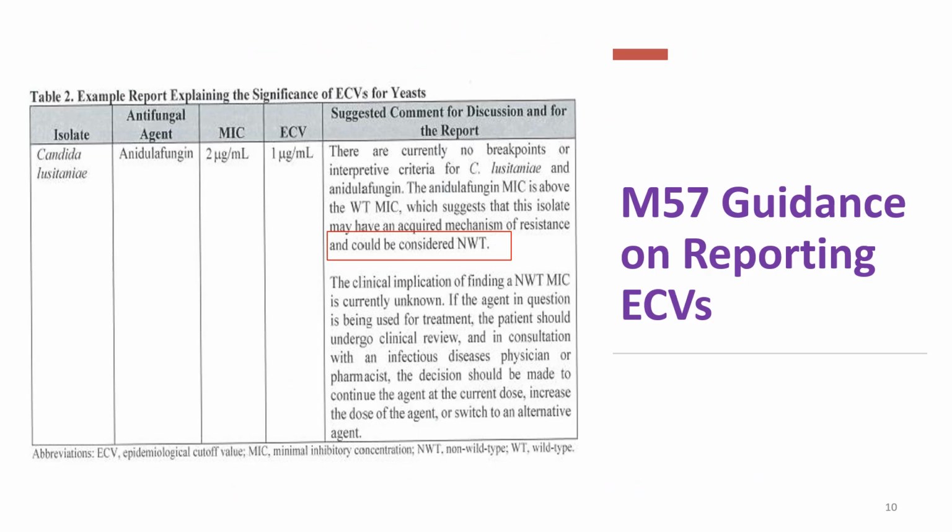Similarly, for example, Candida lusitaniae: the MIC is 2, while the ECOFF is 1. So since the MIC is more than the ECOFF value, it belongs to a non-wild type. That means it has some resistance mechanism. Now, if the agent in question is being used for treatment, the patient should undergo clinical review. And in consultation with the admitting physician or pharmacist, the decision should be made whether to continue the treatment or not.